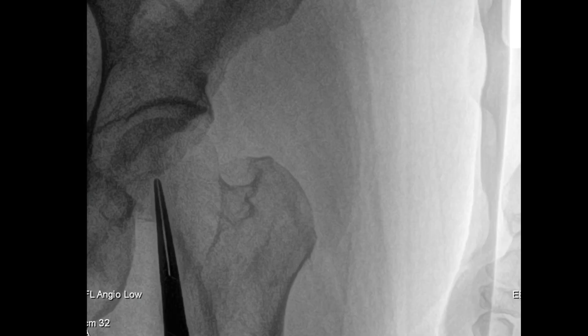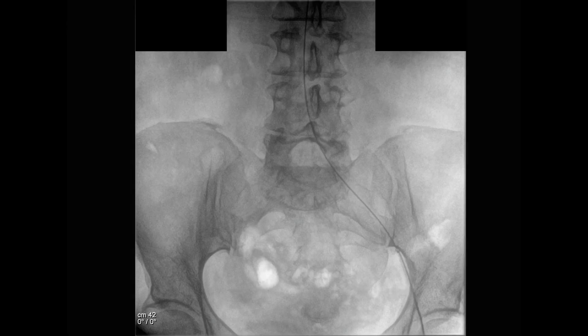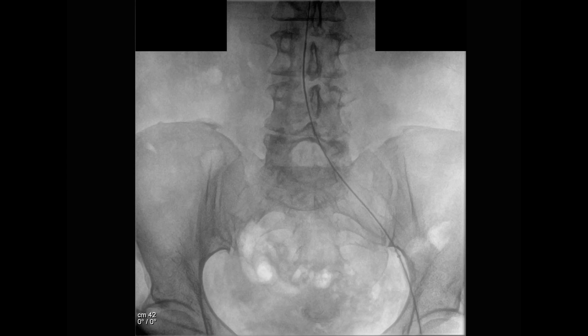We began our procedure by using ultrasound guidance and fluoroscopic guidance to access the left common femoral artery. This artery was accessed with a mini-stick needle followed by the wire and micropuncture sheath. We then upsized to a 5 French sheath and a flush catheter was introduced into the abdominal aorta.